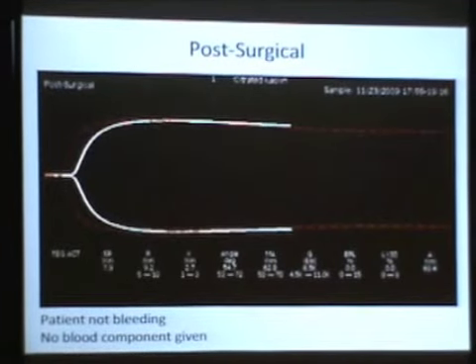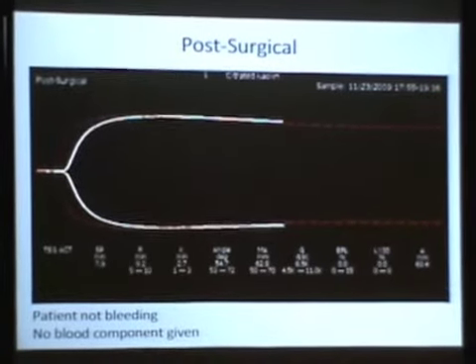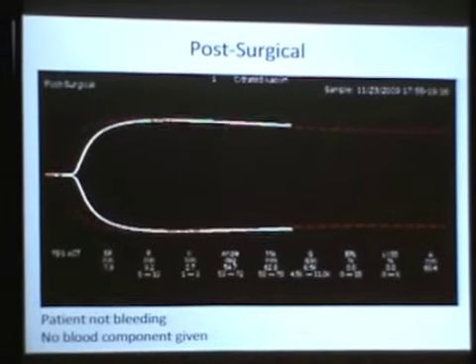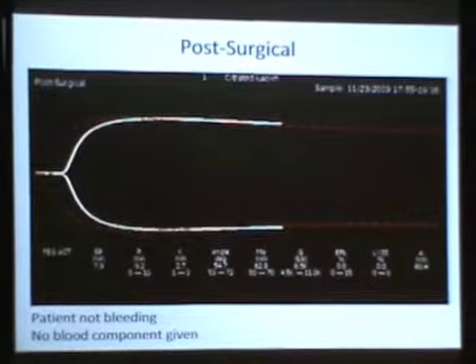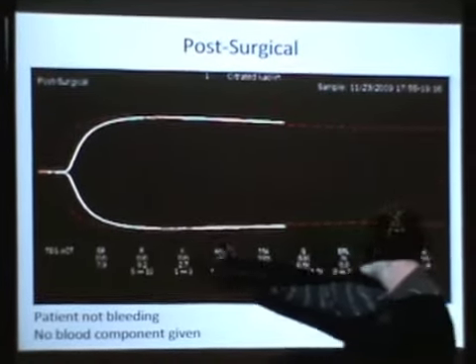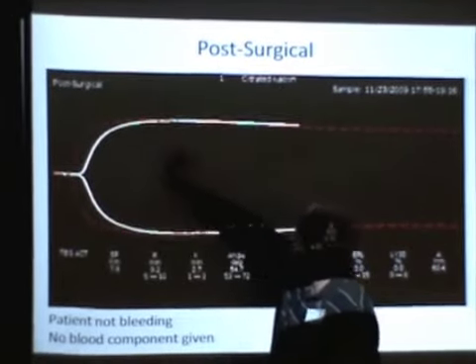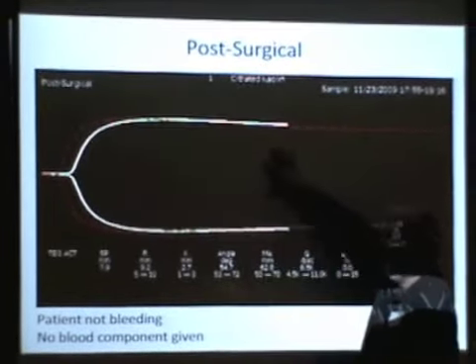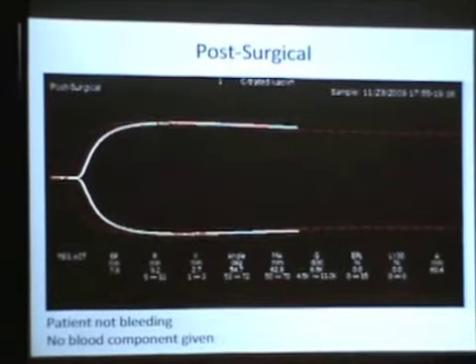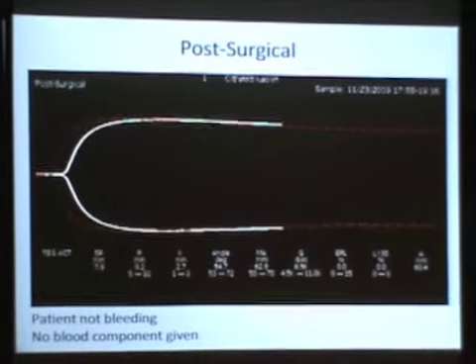One case I wanted to discuss real quick. The most dramatic case I saw here, I happened to be standing there when it happened. Over-heparinization always happens occasionally. You can tell that this just goes like this, and then it comes out and looks like a little fondue fork. Way too much heparin. Doesn't allow anything to get started. Just overpowering everything.